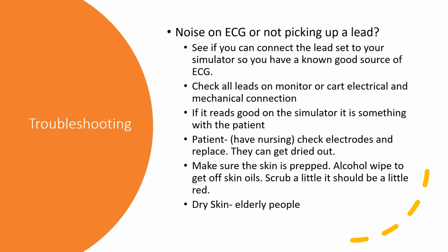Check all the leads on the monitor or cart, electrical and mechanical connection. I know on the 12 lead, it's actually 10 leads, we have the trunk cable, which goes from the ECG box out to the patient. And then on the ones that I have, we have a short little lead that's maybe 6 inches long. Do you guys have that? Ours have alligator clips on them.